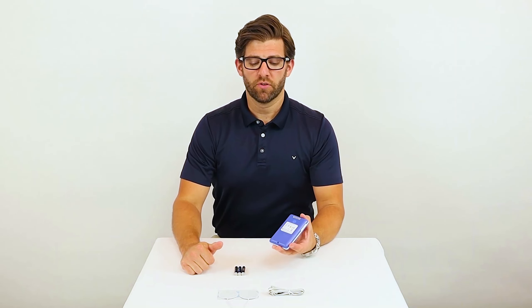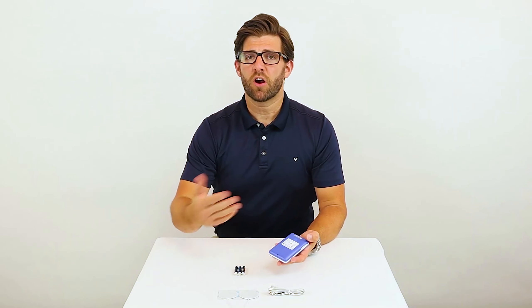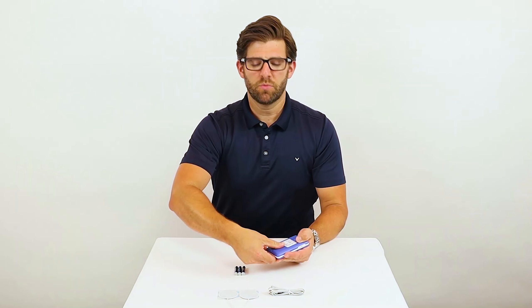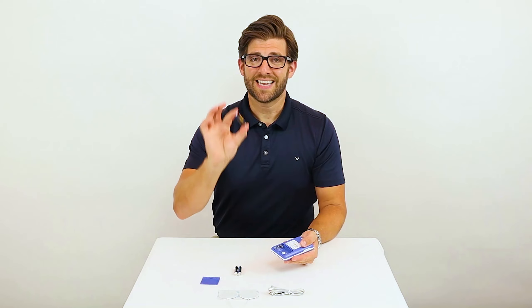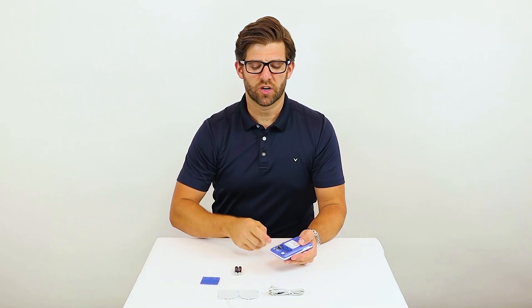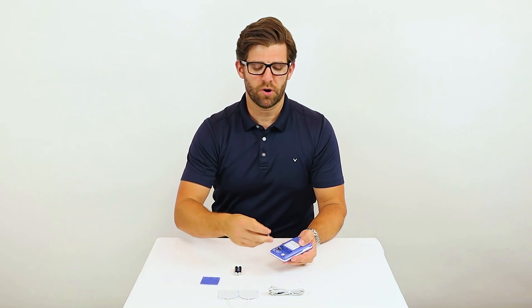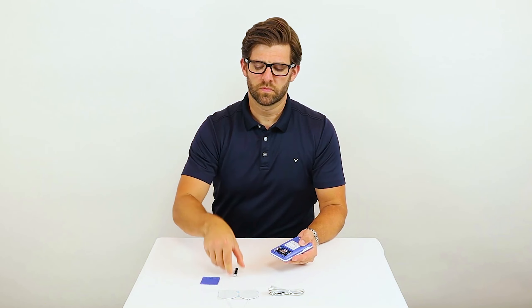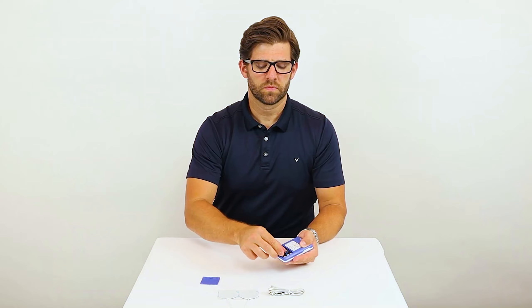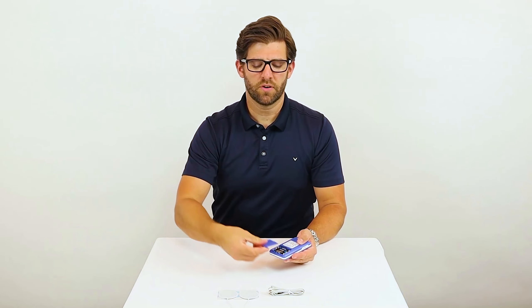To do this, turn your unit over, remove the set screw, which I've already done to save time, and then remove the battery case cover. Next, insert your batteries according to the instructions written on the inside of the Sable Stim Pro. Then replace the cover and the set screw.